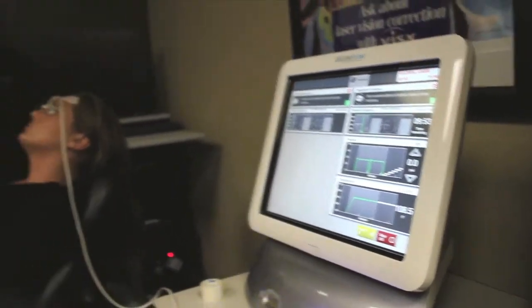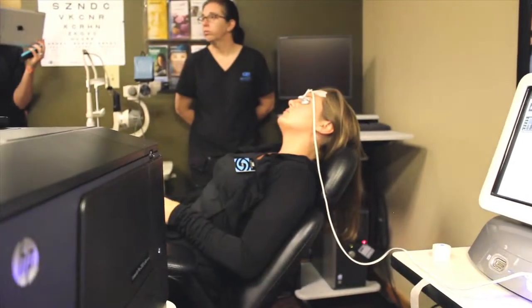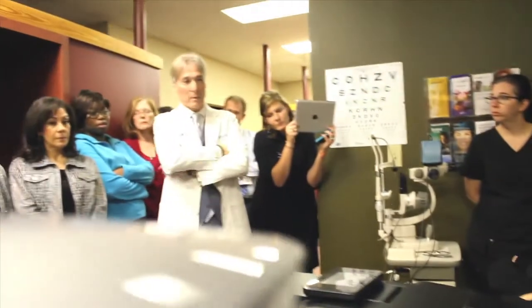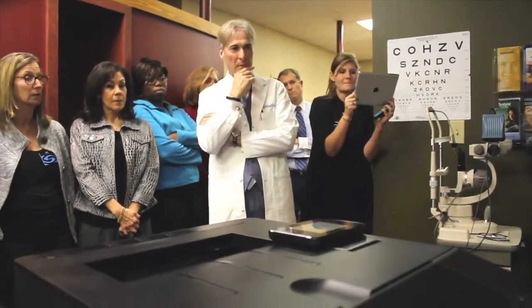Right now it's warming up the gland and slowly squeezing it, so you don't feel the slow tightness. She's going to feel it when it starts pulsating. It actually rolls up. Do you actually get stuff coming out of the glands? Yeah, it's draining the whole thing. Wow, and where does all that go? Into the tears, and it just gets dissolved. Remember, it's already heated up. It's liquefying that oil, and that's what it's supposed to do.